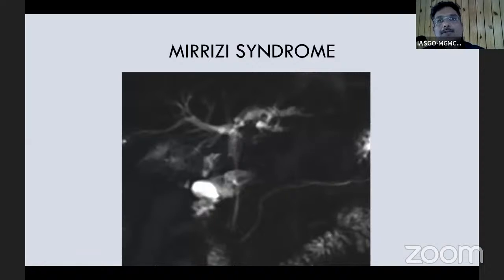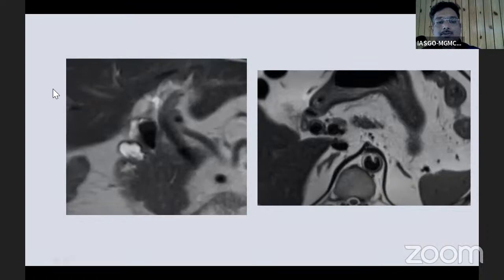Another important indication for MRCP is Mirizzi syndrome. Here in this case, we can see a large filling defect, which is effacing the CHD and resulting in biliary dilatation proximally. These findings are better displayed on T2-weighted images with the large calculus here, effacing the CHD, and here we can see the calculus there.